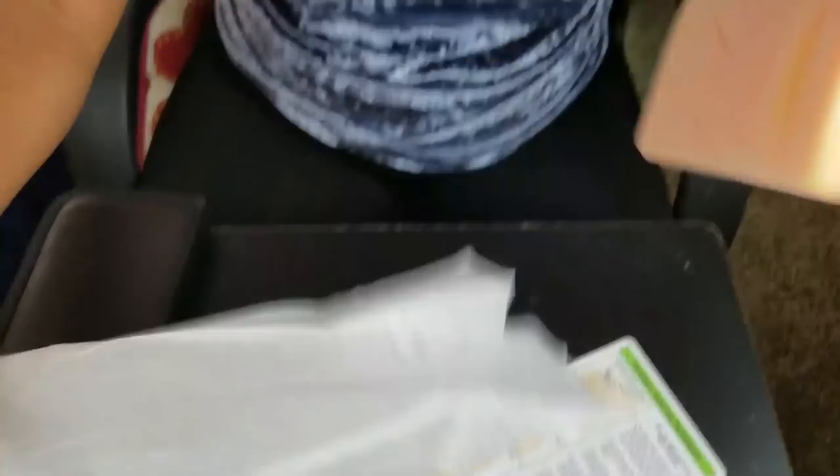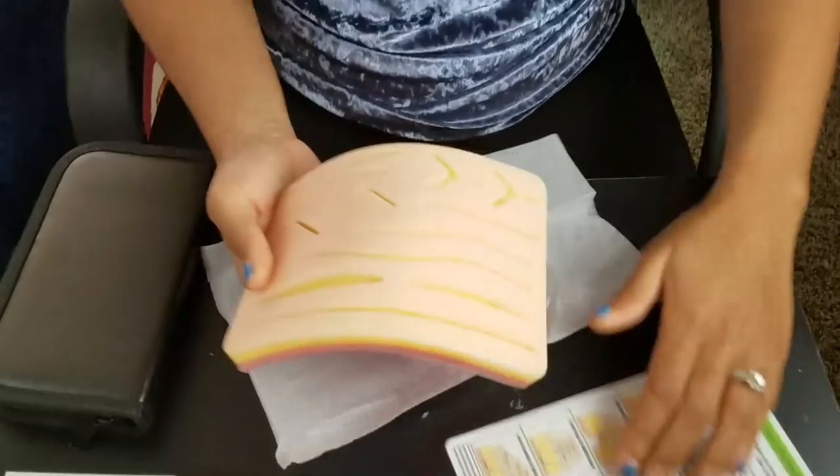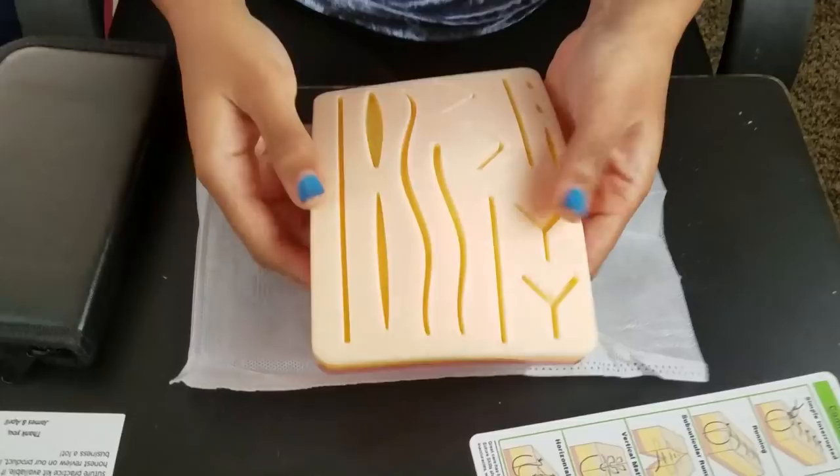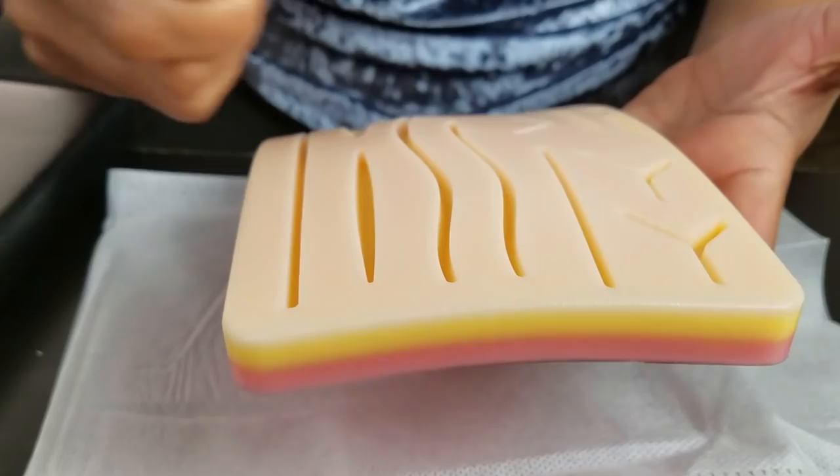It also gives you tips for the different skin closures. I already like this suture kit. It has your epidermal layer and then your dermis and sub-Q going down — so it has the layers. It feels very, very sturdy. It doesn't seem like your suture is just going to rip through the actual skin-like material, which is really cool because I've practiced on some kits where my needle, when I put it in, doesn't hold up to the stitch and just rips right through. So excited about this.